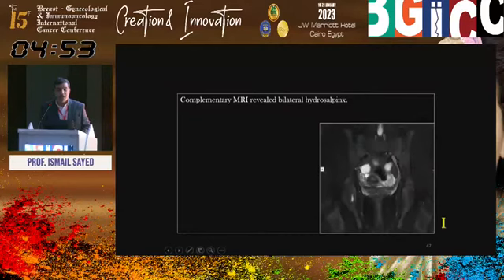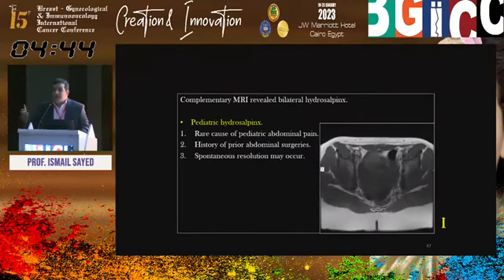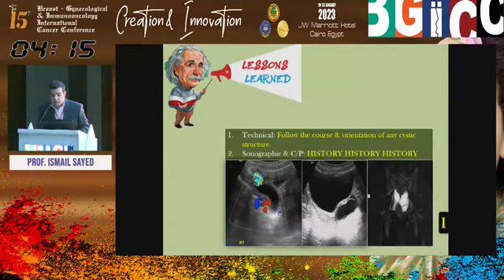So she has bilateral hydrosalpinx, 9 years old. This is called pediatric hydrosalpinx, uncommonly seen, but usually after abdominal surgeries like appendectomy, and may have spontaneous resolution, okay? So this is hydrosalpinx in young age. The trick here is the elongated pattern, tubular structure, especially on the left. On the right, you may think of mucocele of appendix, okay? But usually you need another imaging modality, like MRI.